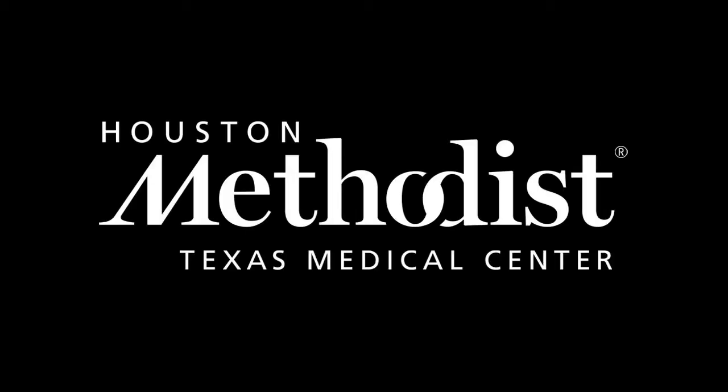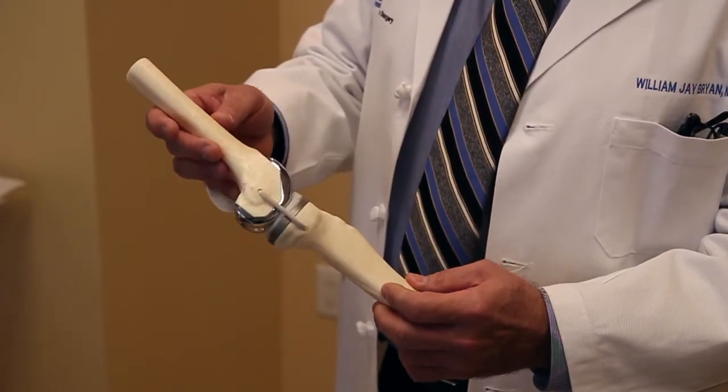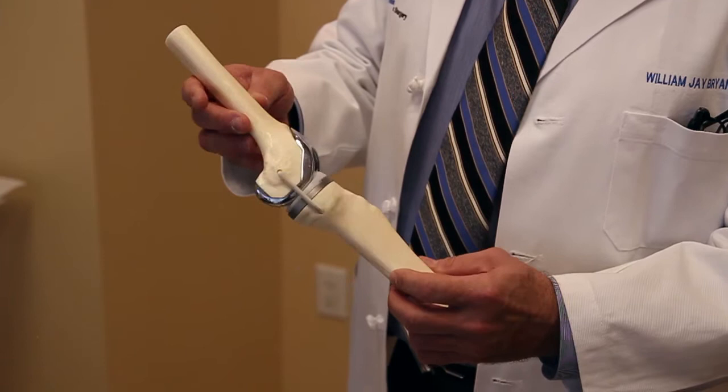Hello, I'm Dr. Bill Bryan, orthopedic surgeon. I have in my hands a typical total knee replacement. Let's go over some of the basic features.